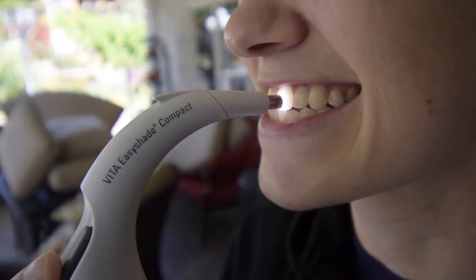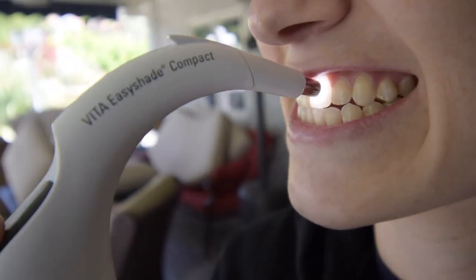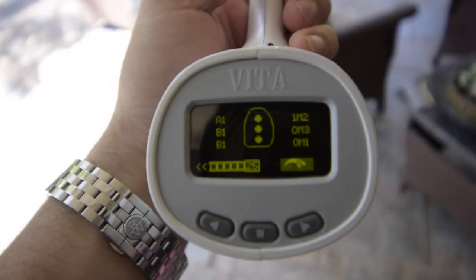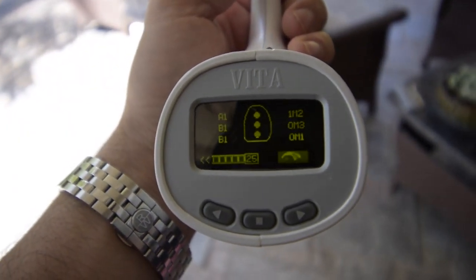There are a lot of ways to use this device. You can use it as a single point system to select the overall shade of a tooth, or a multi-point system which will measure the shade from three different areas: gingival, body, and incisal edge. You can also check the shade of a crown. They also have a newer system called the Vita Easy Shade 5, which has a bunch of other incredible features. For today's video, I just want to show you how I use this device and how it helps me select shade.